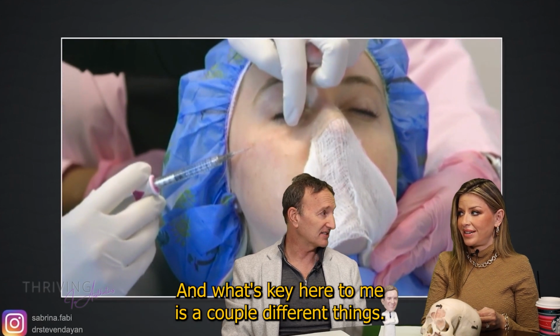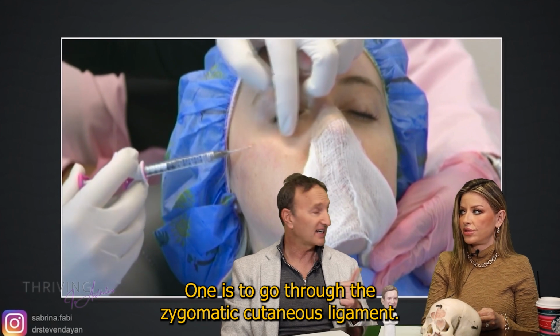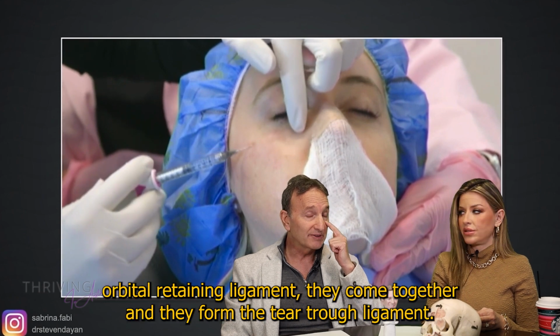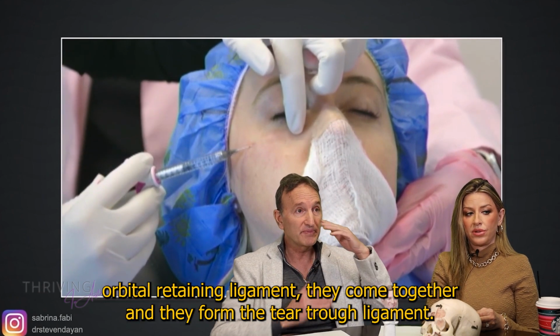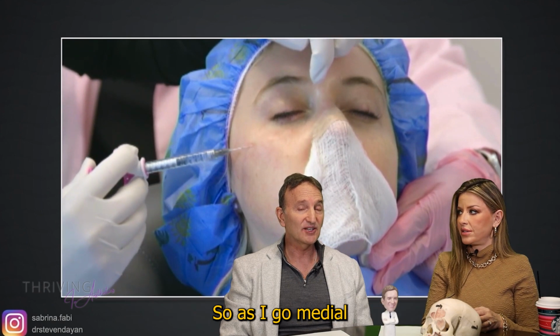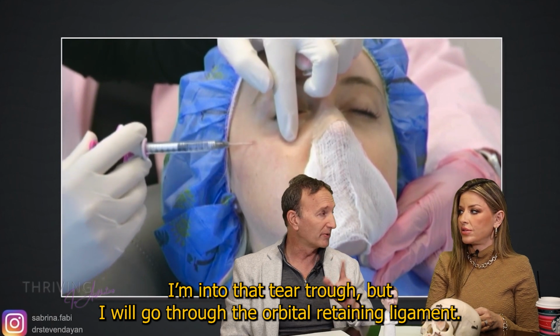And what's key here to me is a couple different things. One is to go through the zygomatic cutaneous ligament, which is a little bit inferior. And that together with the orbital retaining ligament, they come together and they form the tear trough ligament. So you're kind of there right now. That's where your tip is. So as I go medial, I'm into that tear trough, but I will go through the orbital retaining ligament.